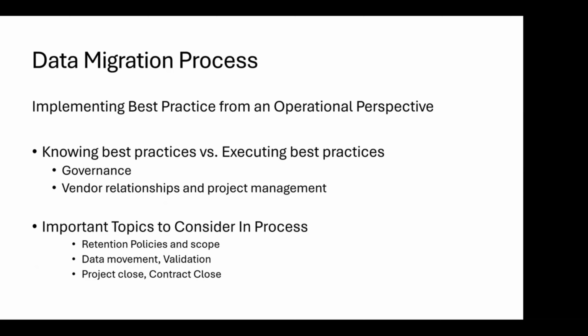And it's very important to make sure that everybody understands the common goals. For us at Maryland, when we did our big PACS consolidation of about 7 or 8 PACS systems consolidating into one, everybody called it the new PACS project. But every slide I presented to leadership, and really any aspect of setting the table for governance, was: yes, it's a new PACS, but we have 3 things to worry about. One is data migration, implementation of the new PACS, and decommissioning of the legacy systems. And the idea there was that they were all tied to each other. Just presenting that over and over gave governance and the group pretty good confidence.